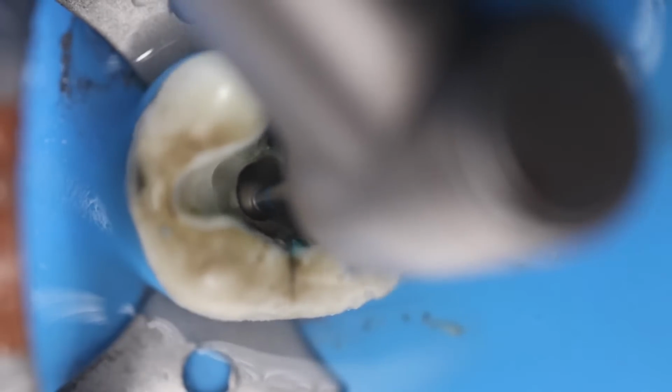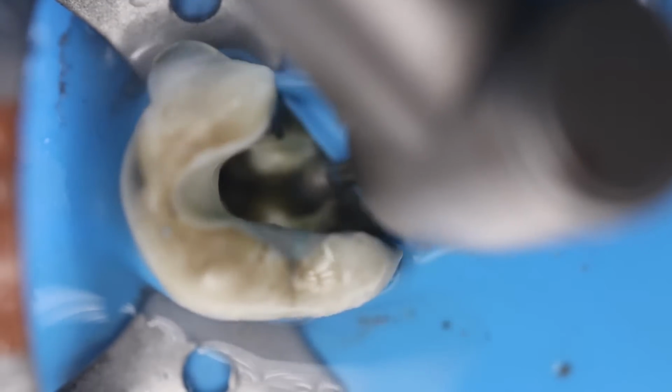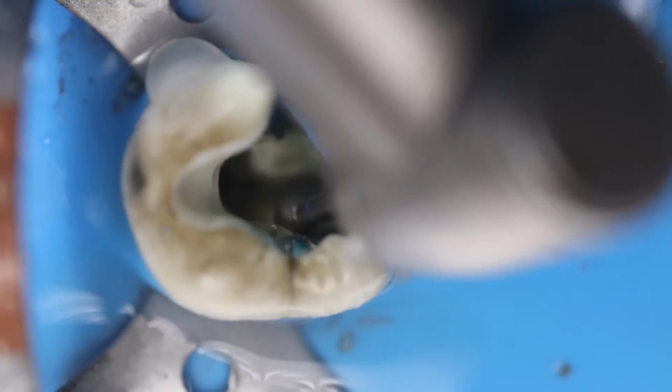See, I have angulated the bur, not going straight into the depth, and not going extreme mesial or extreme distal, removing only the caries part and the infected or necrosed segment of the tooth.